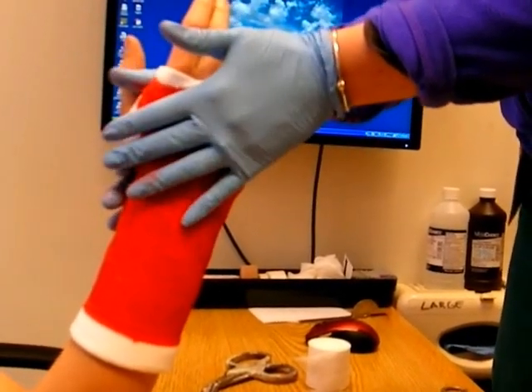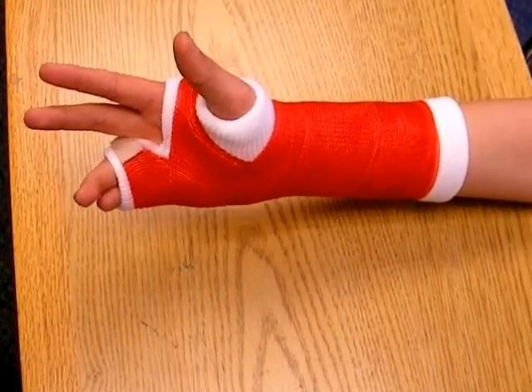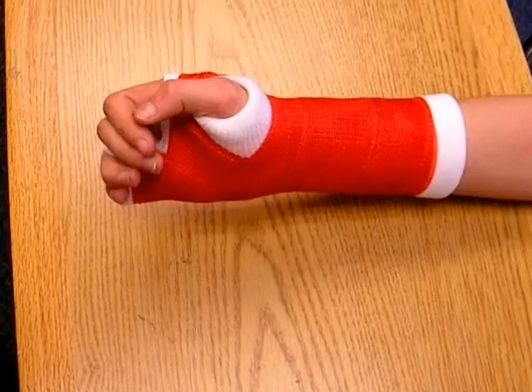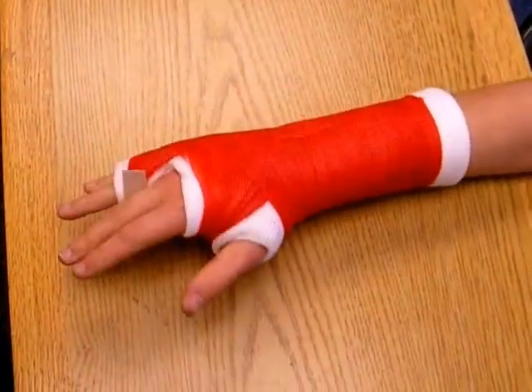Finally, the cast is molded into its final position. You can see here the freedom of motion that it allows the patient's other fingers, while completely immobilizing the fingers — at least the parts of the fingers that do need to be immobilized.